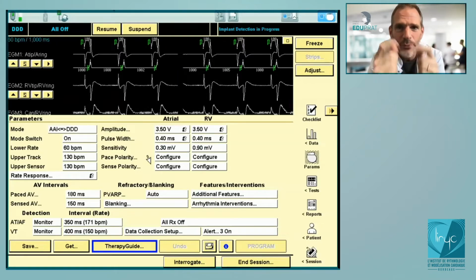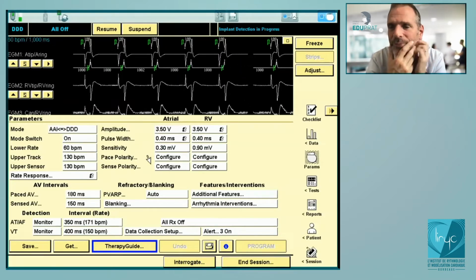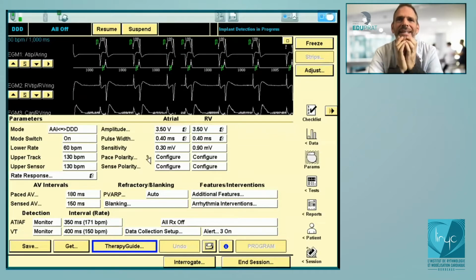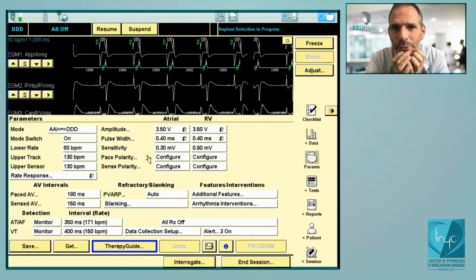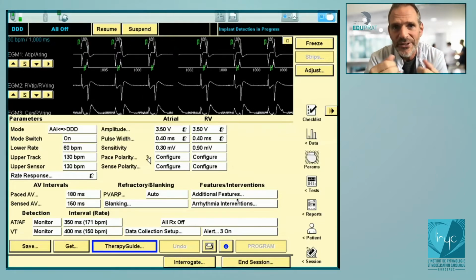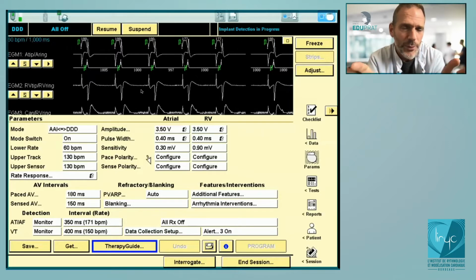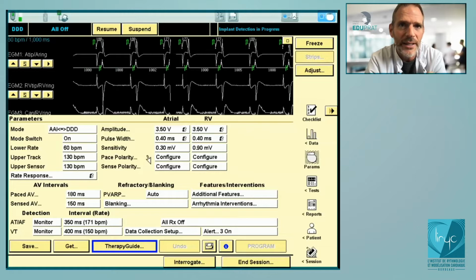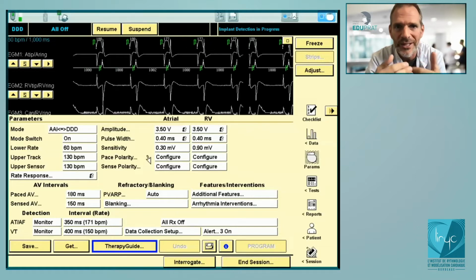After 30 minutes, he will repeat this test and will perform measurements of impedance in bipolar pacing. And if it works properly, it will then remain in bipolar. So either you interrogate the device and program it, and there's no problem. But if you do not interrogate and program, that's how it will work for the next 30 minutes.